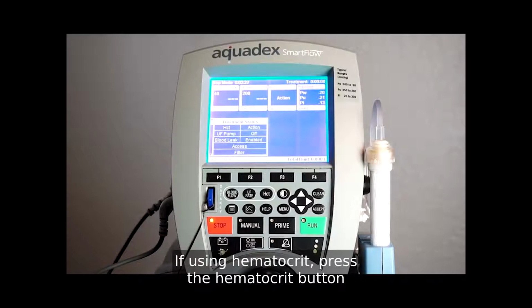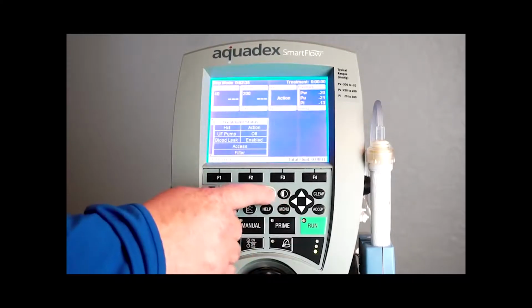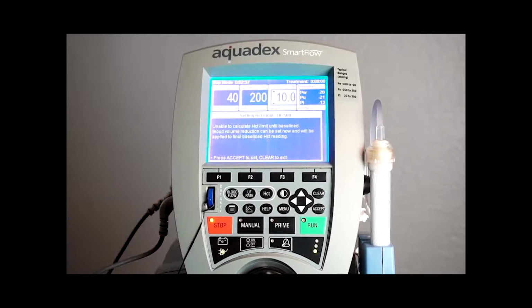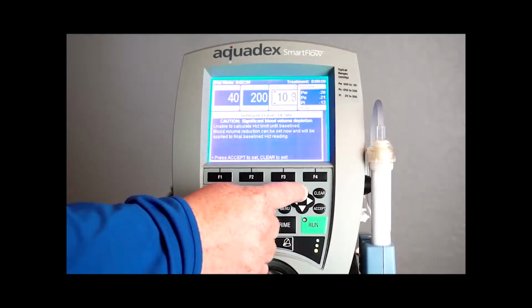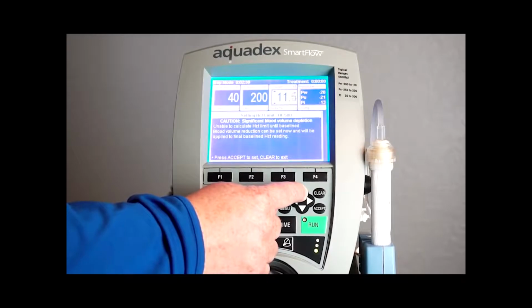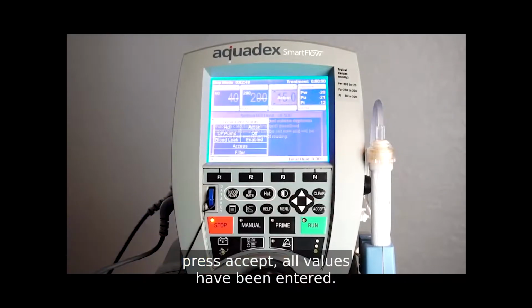If using hematocrit, press the hematocrit button to increase your hematocrit limit to prescribed rate. Press accept. All values have been entered.